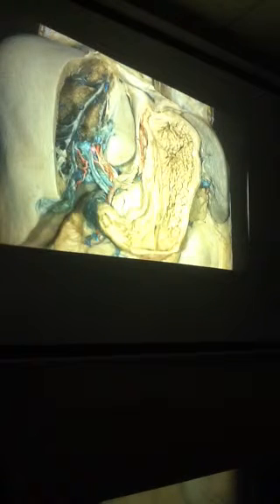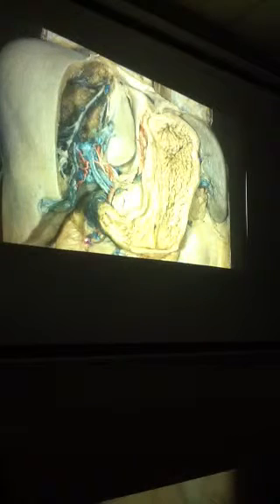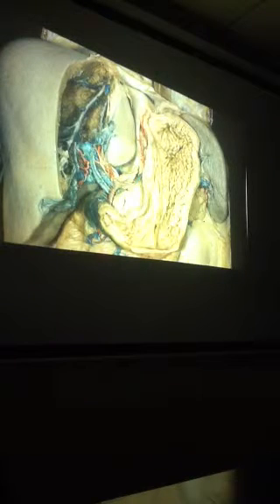But the best thing about this slide for you as a professional is to see this tissue, nice and focused, which is nestled into the duodenum. It's all right here, right on the edge. And it continues plastered against the posterior body wall here, and you see it all the way out to here, nestled up against the spleen.